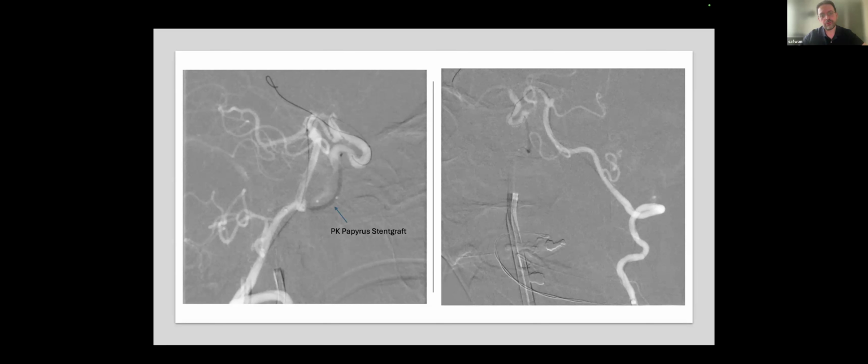And in order to reach really high, it was necessary to have a really supportive wire. So we tried the Synchro Support microwire, which was giving enough support. But in some cases, when not able to go higher, sometimes we make an exchange maneuver.